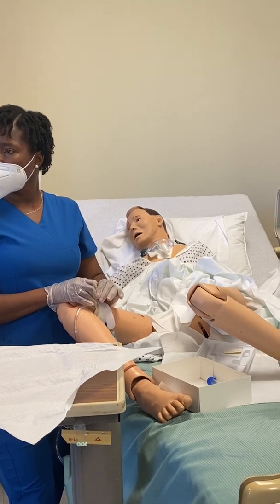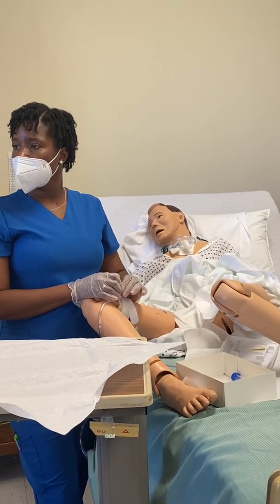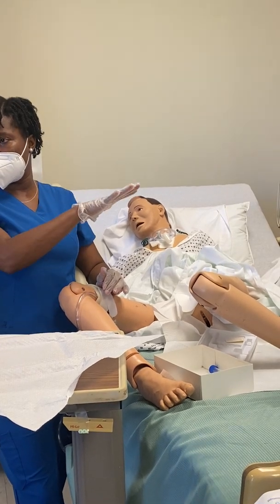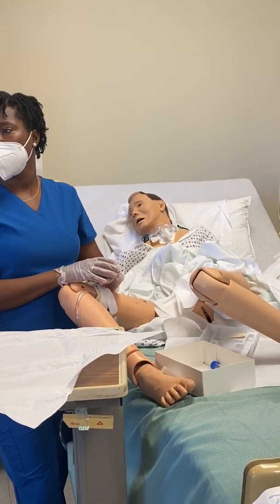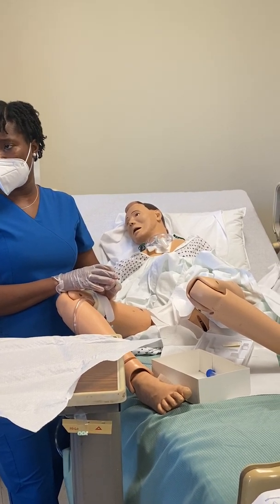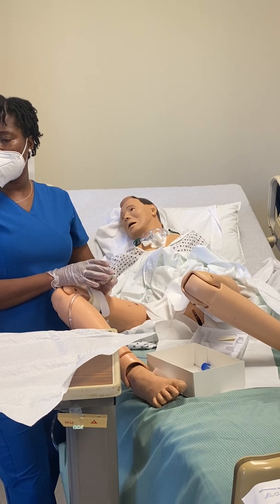So, you have your sterile gloves on when you're taking it out too? No, it's not a sterile procedure to take it out, it's just that I'm doing it at the end of this. Okay, so you're washing your hands and then you would come back and then take it out? Yes, once you get a moisture-proof barrier there and you assess, then you take it out.